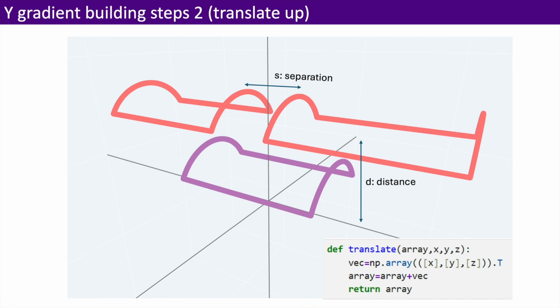So that's why in step 2 we define a translate function which takes a coordinate array in the shape of n by 3 and also takes the input of desired xyz coordinates by which we want to shift the center. The vector is defined as the input desired coordinates, and then the array is summed with the vector and the array is returned, so we get translation. In this case we use translation up. Similarly we will use translation down, but for translation down first we need to mirror the saddle coils, and here the parameters we use in translation are defined from separation and distance.